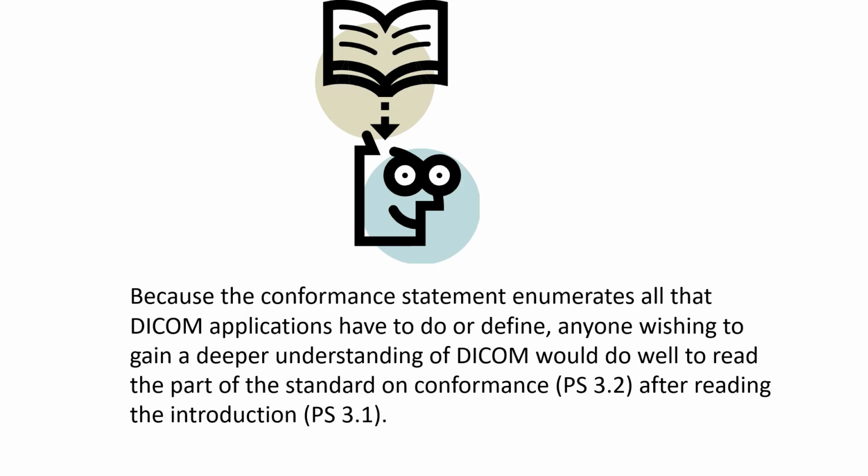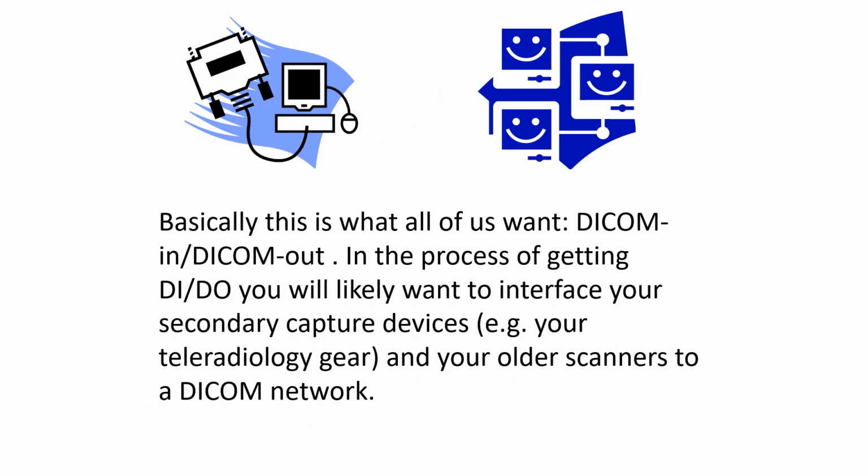Because the conformance statement enumerates all that DICOM applications have to do or define, anyone wishing to gain a deeper understanding of DICOM would do well to read the part of the standard on conformance after reading the introduction. Basically, all we want is DICOM in and DICOM out.